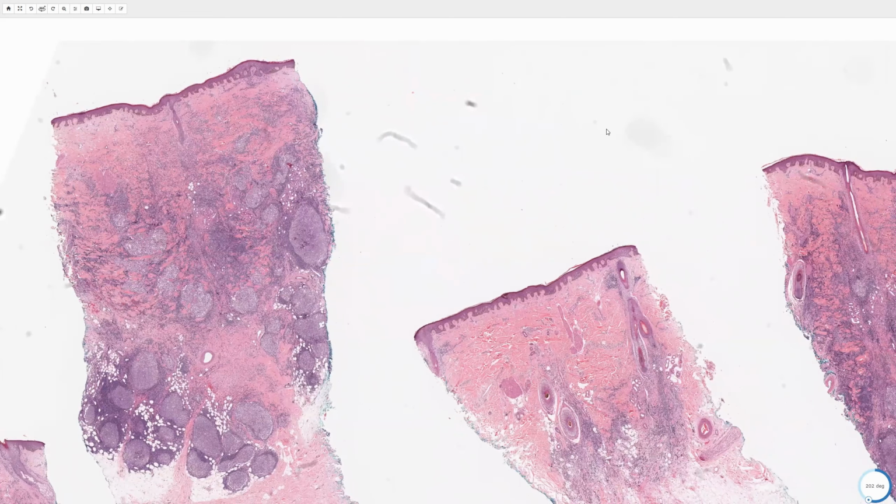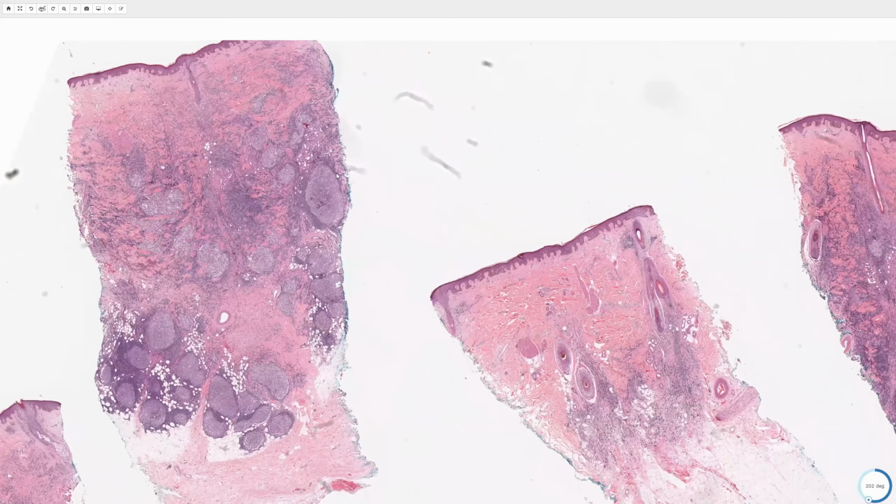To initially work up a lymphoma, we often start with CD markers if they're not so well differentiated. The example I'm showing here has some germinal center phenotype, where you can see that it's recapitulating what we would see in a normal lymph node architecture, with pale areas centrally and a surrounding rim of smaller lymphocytes. This is what we would typically see in a normal lymph node.